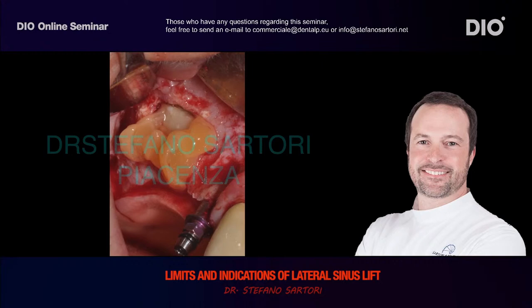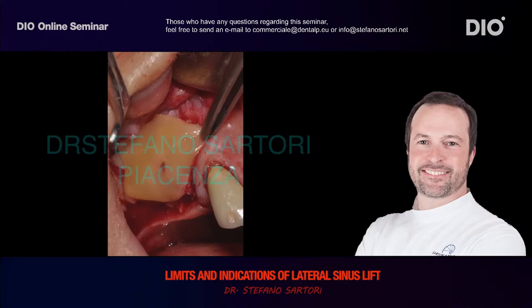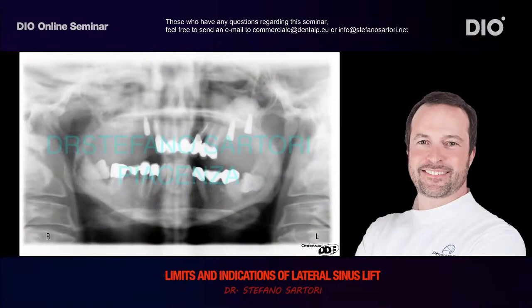At the same time, if you can see the implant in the region of the right canine, you can see that the bone is very thin. So I have corrected the bone in the region of the canine, as you can see here, with bone chips, the same bone chips that I have removed with a scraper from the block of bone. Then I have covered these bone chips with a PRGF membrane, 2 layers of PRGF membrane, the sutures, the X-ray after surgery, and I show you the video.